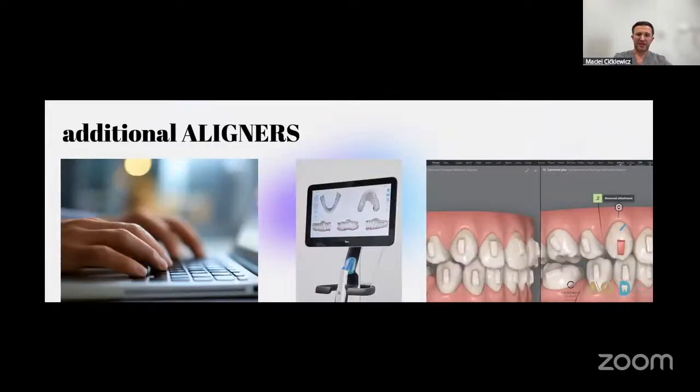Additional aligners are another step you can use to speed up your treatment. Think about this element here. The problem, for example, if you're creating the order of additional aligners: here we have the normal order, and you have to think about not deleting your attachments, because during certification, when teaching other doctors, the idea is that you have to delete the whole old attachment and create a new one.